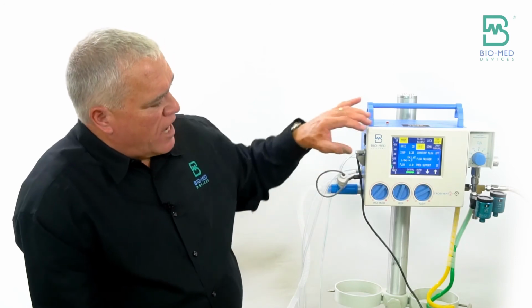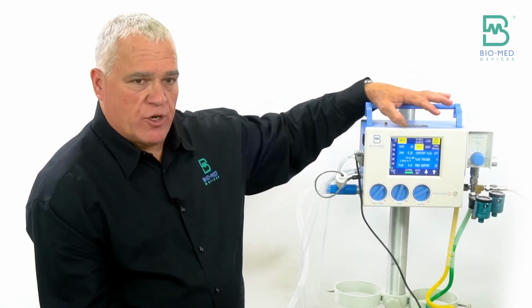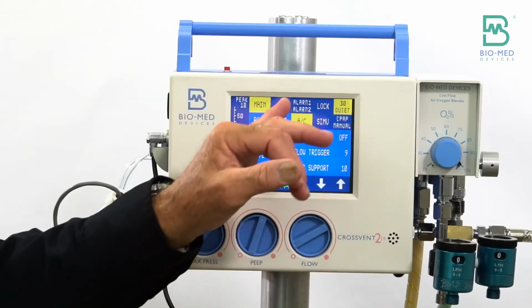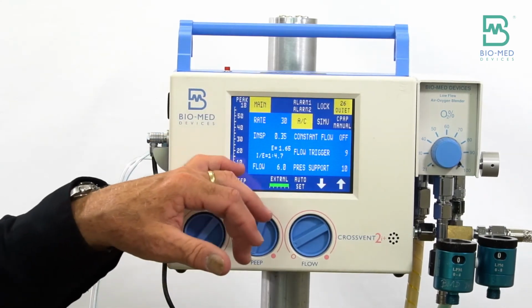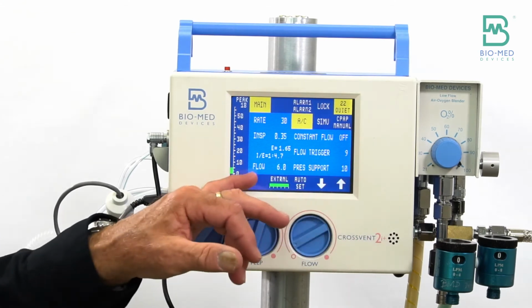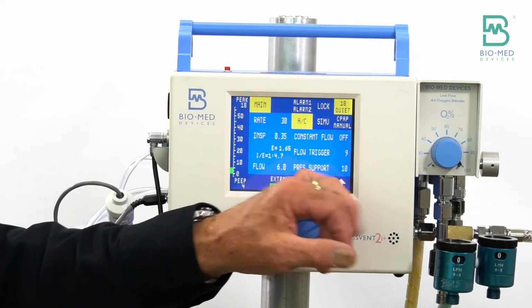So it's really important to keep this in mind. It's kind of a natural thing that the physicians may say, hey, what kind of volumes are you getting when you put this patient on the vent? Before you blurt this number out, 8, make sure that you know whether you have a leak or not. And since I'm above 3, I do have a leak.